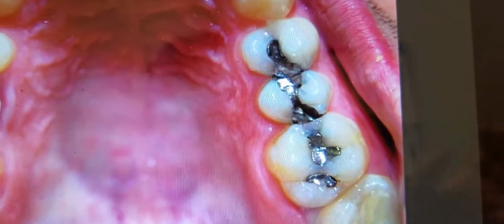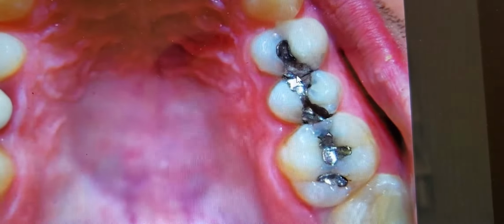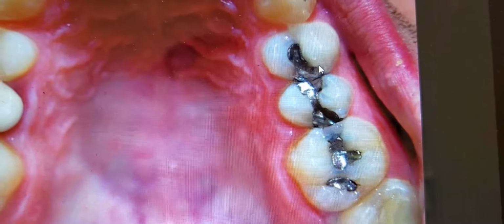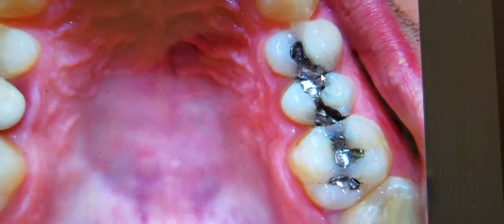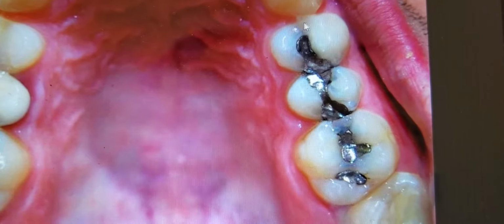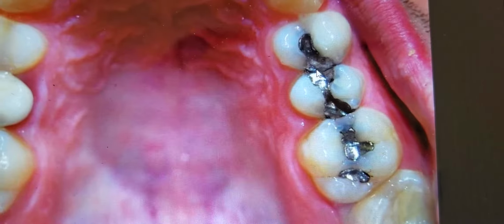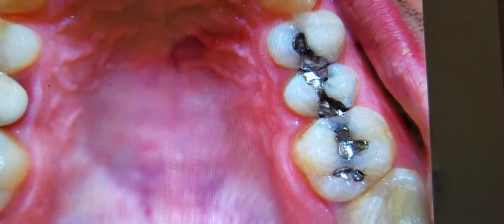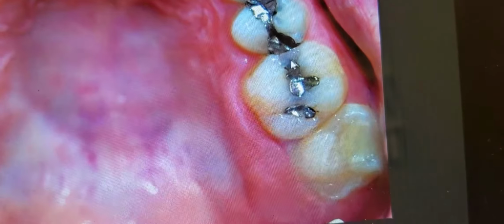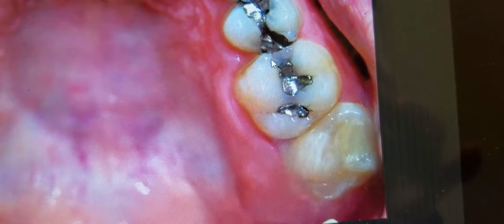In looking at these amalgam fillings, you can see this tooth, this filling, number 12, is touching the distal, but not the mesial. So this is a DO amalgam filling, number 12. Number 13, MOD amalgam. Number 14, occlusal amalgam. And that's how you'll call those out in your charting.